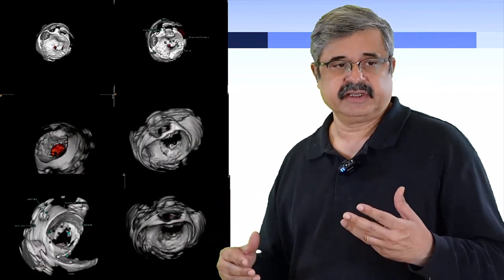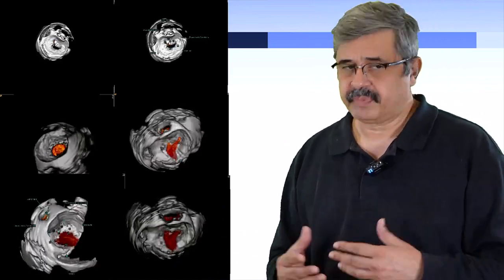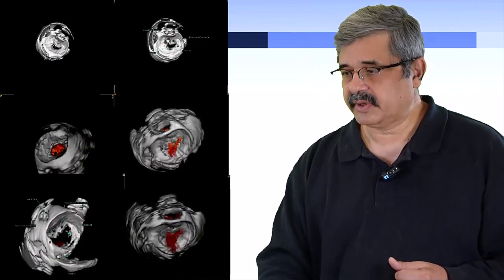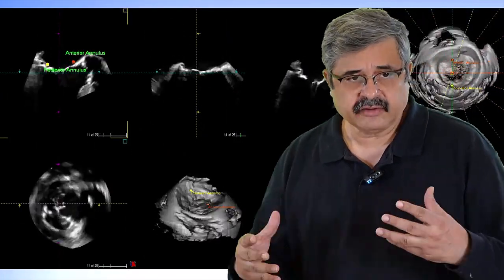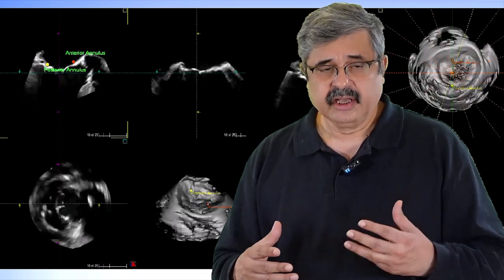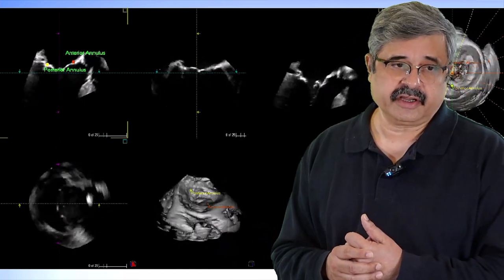Multiple other pathologies were diagnosed using this system. You can see a paravalvular leak in this patient, as well as two regurgitation jets and a paravalvular leak in another. Similarly, a P2 regurgitation jet coming centrally, and another case showing two regurgitation jets from P1 and P3 locations. Provided the patient was in sinus rhythm, you could get gorgeous images. But the greatest advantage was not just good images — it introduced us for the first time to quantitative imaging of intracardiac valves.